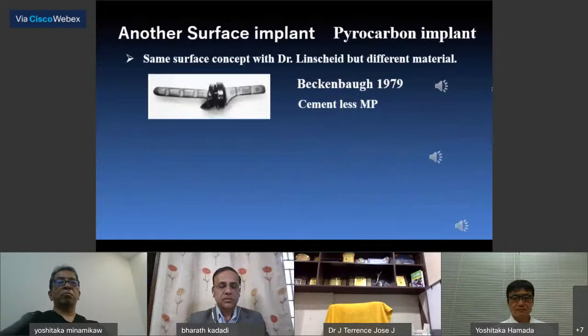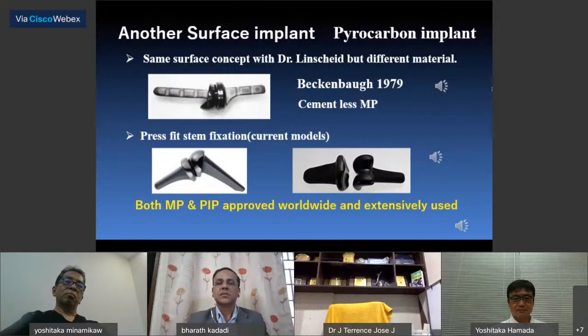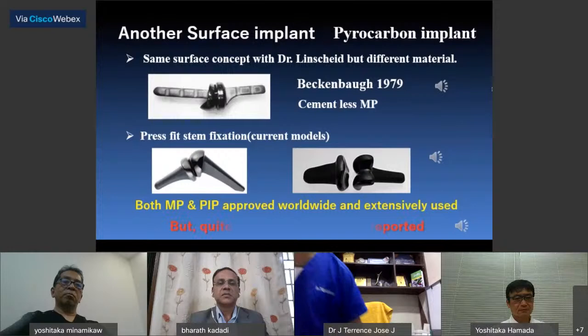Another surface implant from Mayo was the pyrocarbon implant by Dr. Beckenbaugh. It has the same surface concept, but different materials. The current model of press-fit fixation has been approved worldwide and extensively used. But quite high loosening rates were reported.